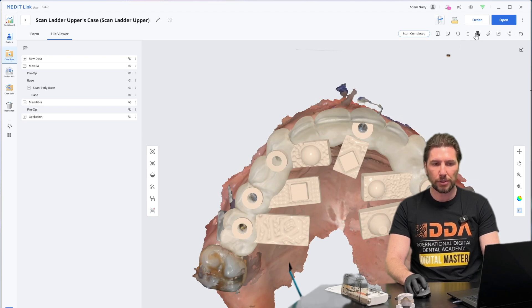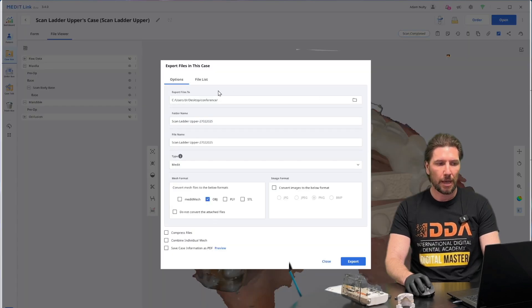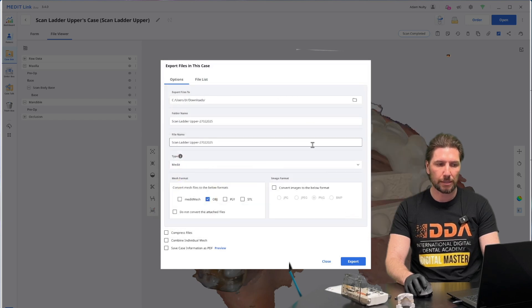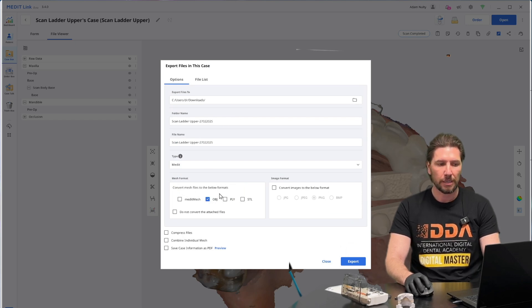If we go to the top right here, you can see there is the export button. We're going to click that and that's going to send it to your choice of location. I'll choose the downloads folder, select that folder, and it's going to export in your choice of format for your appropriate CAD software.